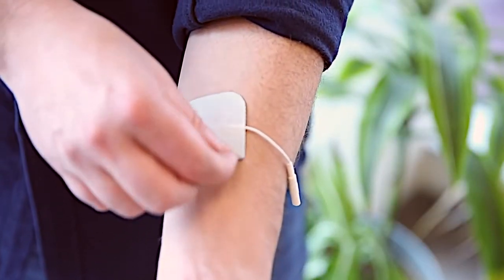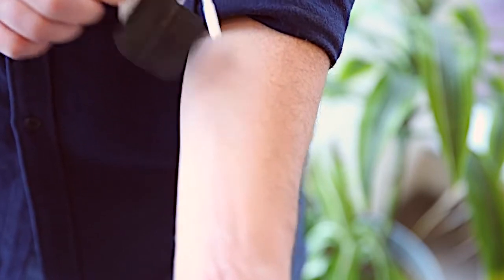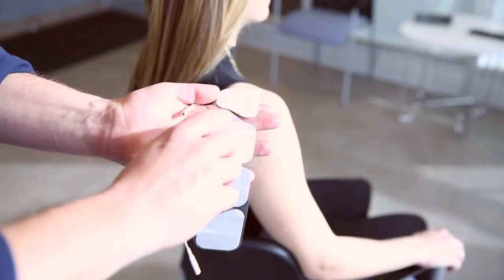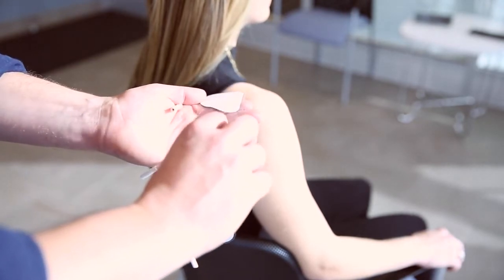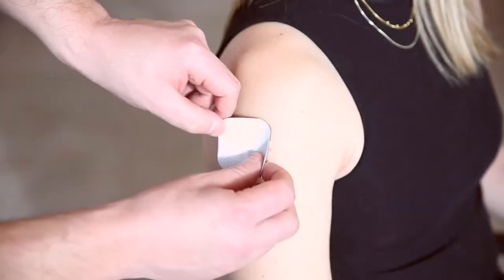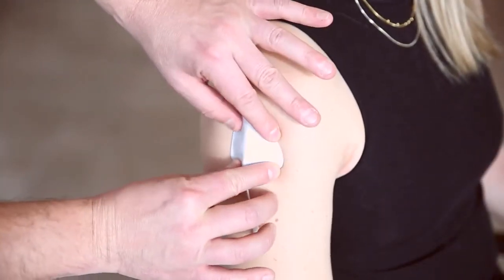The lead wire pigtail. To use, simply pull the tab and quickly remove or apply the electrode without pinch. Not only is this electrode easy to use, the durable tab increases the longevity of the electrode for multiple uses before replacing.